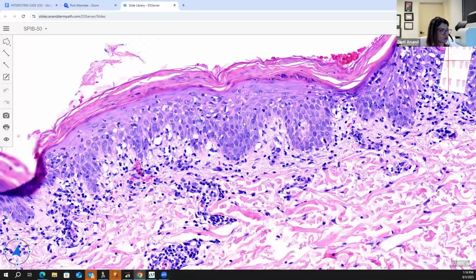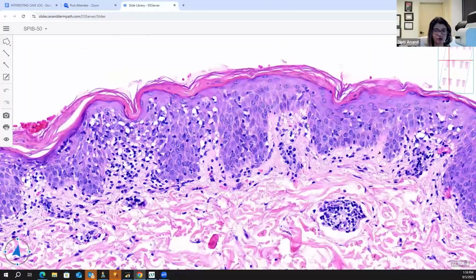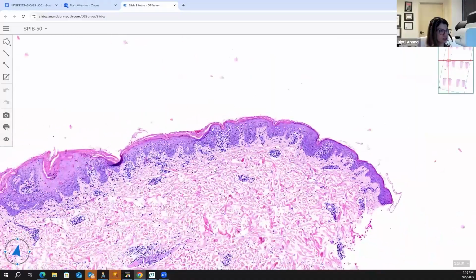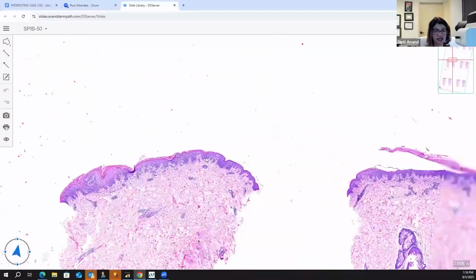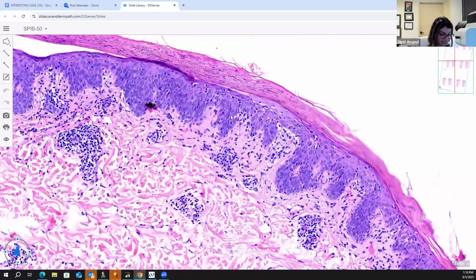You get it? If you can explain the cause of the lymphocytes in the epi, it's not MF, which you have plenty of cause over here. Is everybody good with that? And I want you to bury this picture in your head because this is diagnostic of Pityriasis lichenoides, like nothing else would do that.